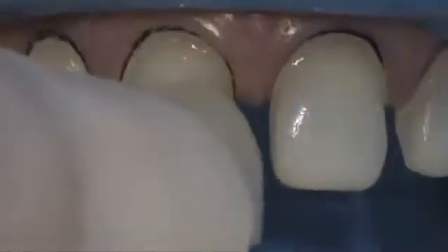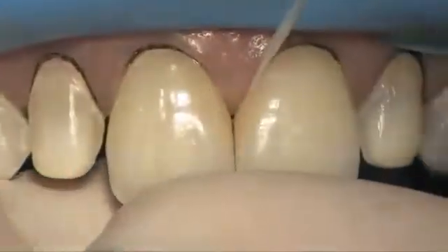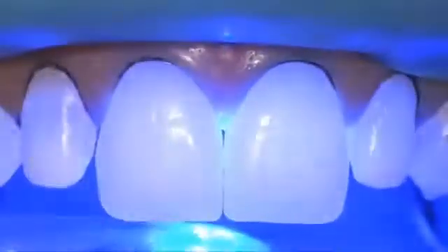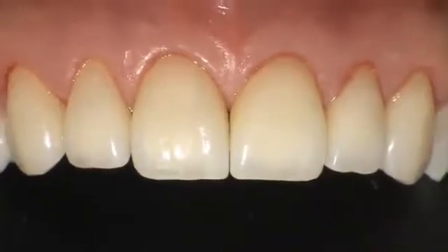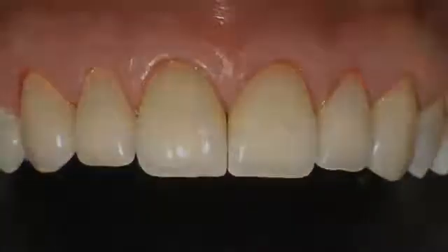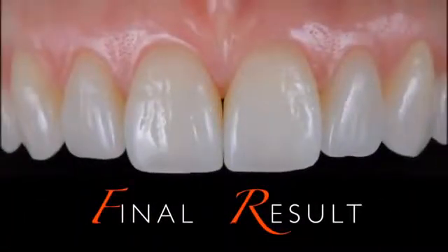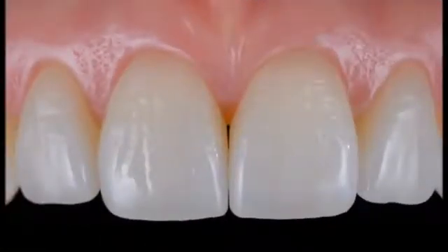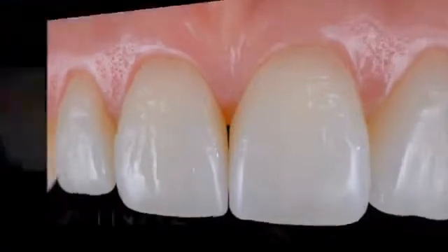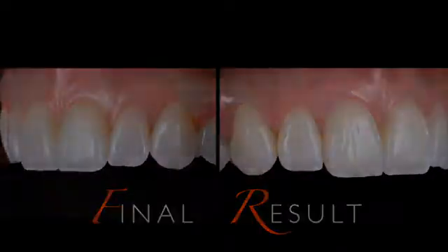Normally the cementation starts from the two central incisors and is followed by the laterals, canines, and so on. During the cementation it's important to remove all the cement excess before the light curing. The use of photography is a great help to transfer all the information to the technician and obtain in this way a real mimetic restoration. Two weeks after the cementation we can appreciate the health of the soft tissue and the mimetic result obtained.